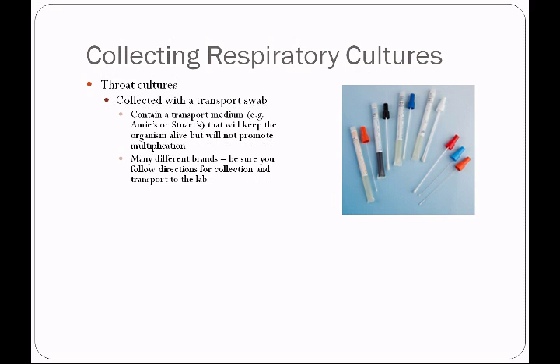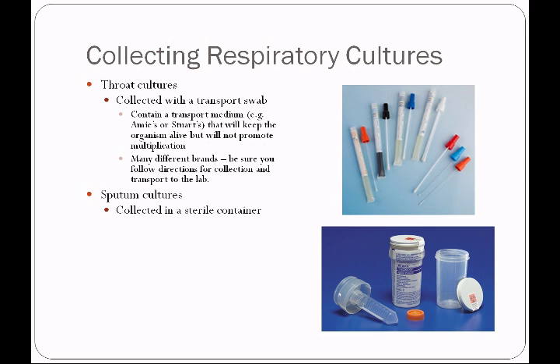There are many different brands, so be sure you follow directions. If you don't know how to use one in your job, make sure you ask someone to show you. Sputum cultures are collected in sterile containers, and here are some examples.